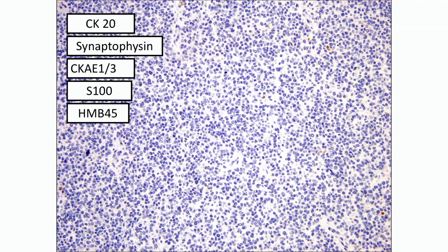Okay, I know now what it is. Not melanocytic. It must be a glomus tumor. SMA, completely negative. In desperation, I did an LCA, and that's negative. So now I'm really sweating. Now I don't know what the heck this thing is. All right, so now what?